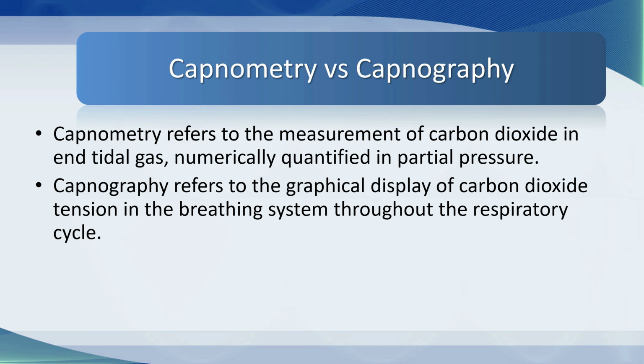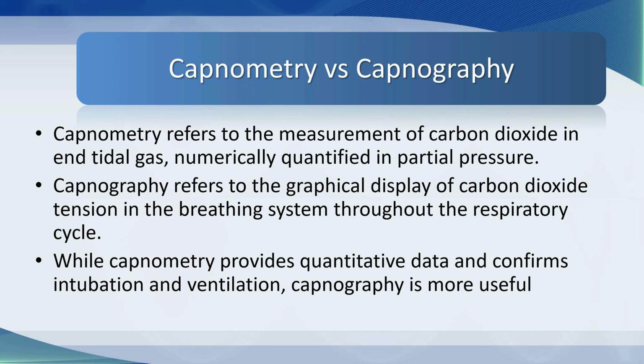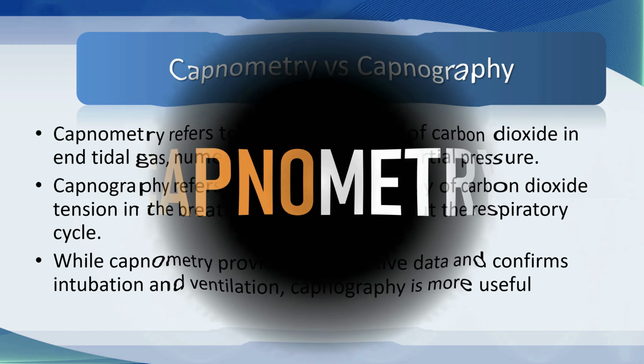The capnographs will always give you a capnometry measurement. There'll always be a number, but you also get a waveform. So while capnometry is great and it provides you with quantitative data and confirms intubation and ventilation, overall capnography is more useful. So let's now talk specifically about capnometry.